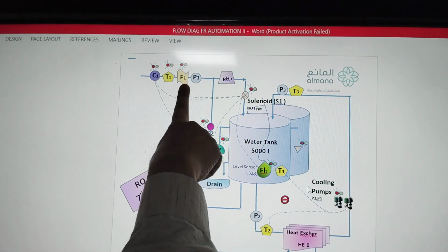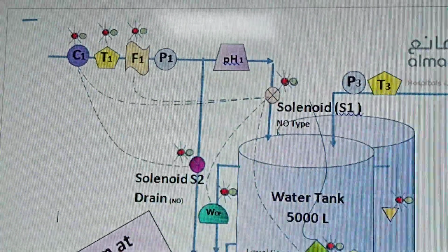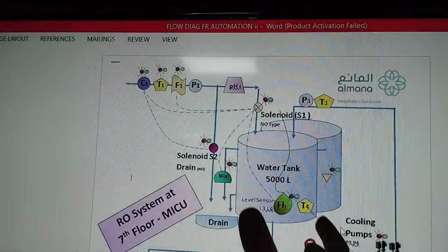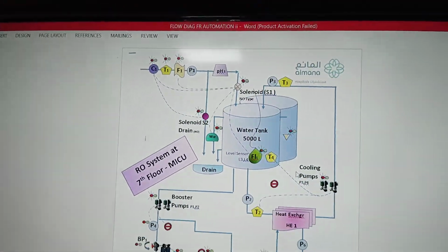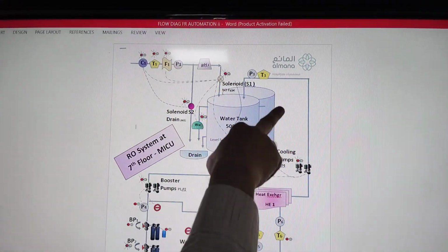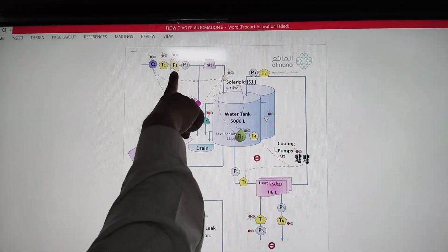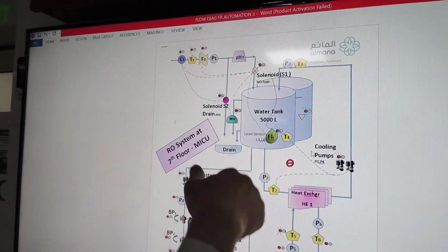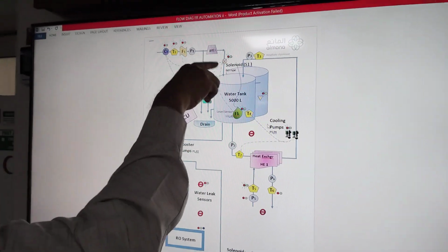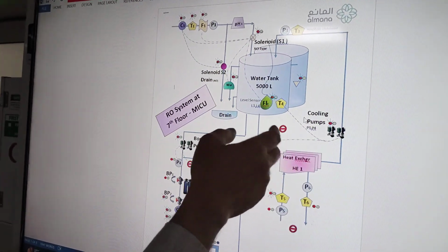Then next it passes through the flow sensor, the flow meter. The flow meter checks the amount of water flowing through the pipe going into the tank. Suppose the daily use is 5,000 liters of water. If it goes beyond that, like 10% more, it will give us an alarm. It will give an indication, plus an alarm, that the water is going more than the required quantity. So to check, we have to see whether there is any leak or anywhere it is overflowing, something like that.